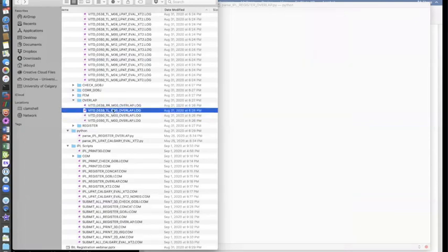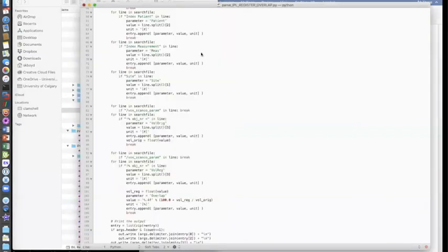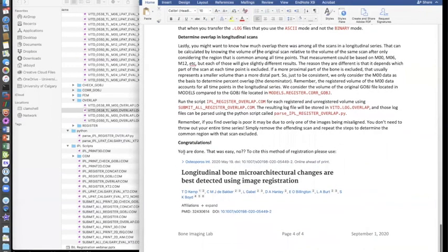And we always use the denominator is the baseline volume, and then the overlap could be the common volume at any one of those time points. And there actually are slight differences, but as long as you are consistent in how you define that, it should be fine. So, and that's it. You're done. So this is not exactly trivial, but quite feasible to do.